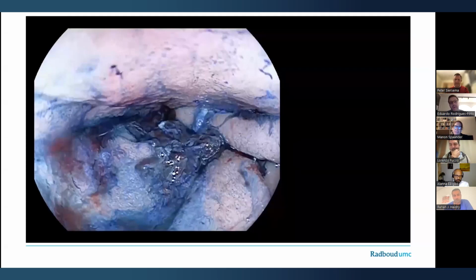Yeah. The issue here, of course, is that suturing the esophagus is not so easy because of the limited space that you have. It can be very tricky, but the devices will improve. Apollo Endosurgery has already launched in the US a through the scope device, which as soon as we have a CE mark will be available here. And instead of an over the scope platform, a through the scope device will allow us to increase the umbrella of indications such as defect closure and perhaps even stent fixation to a more general user audience. Well, thank you very much.